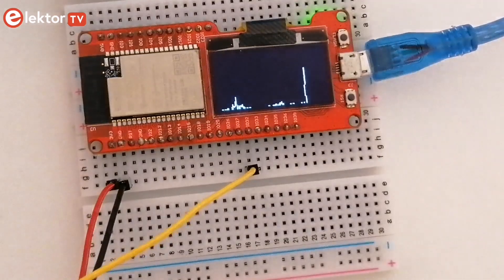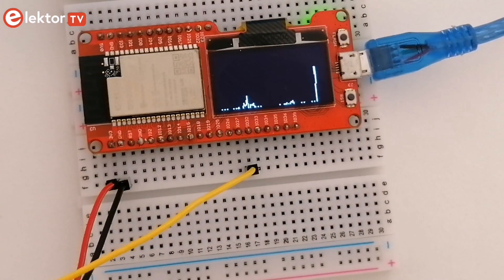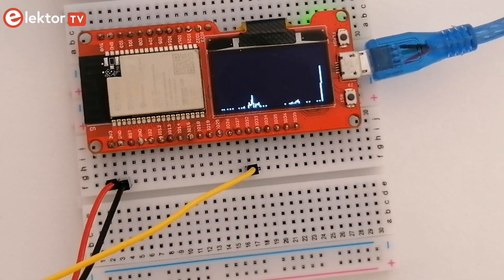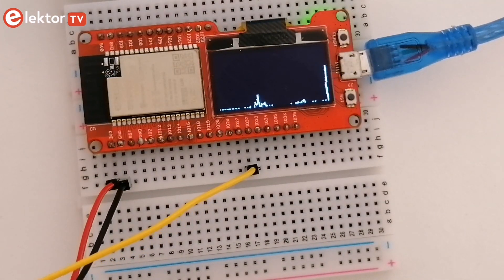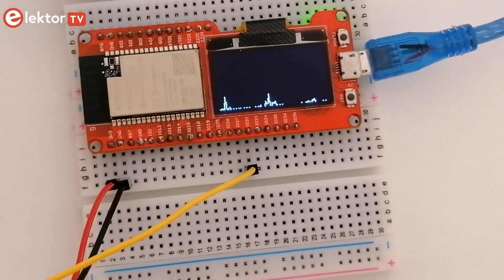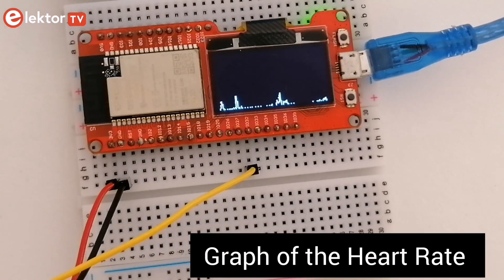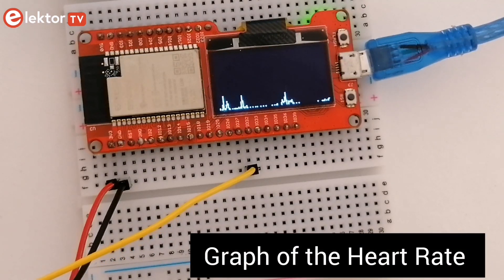Now all you have to do is run your program. When the program is started place your finger on the sensor and wait for the graph of the heart rate to appear.